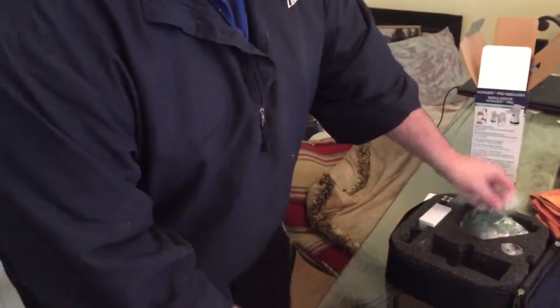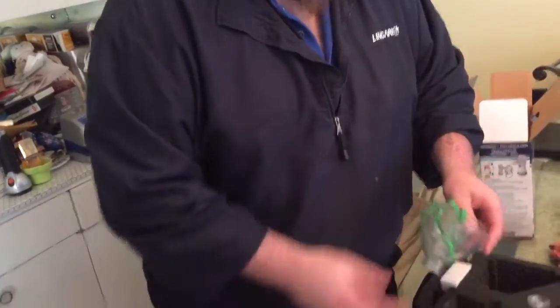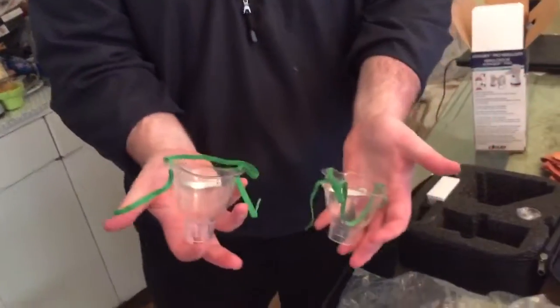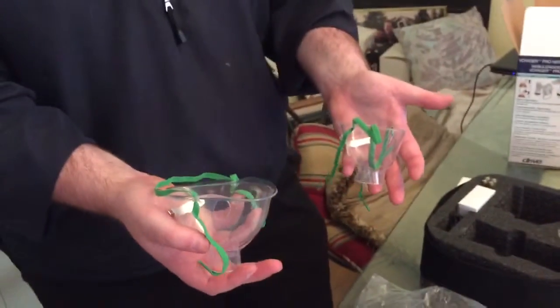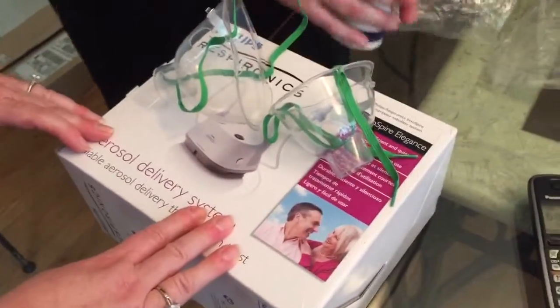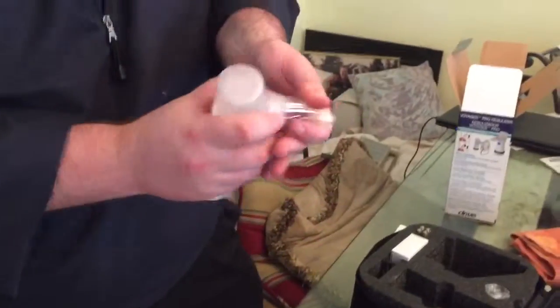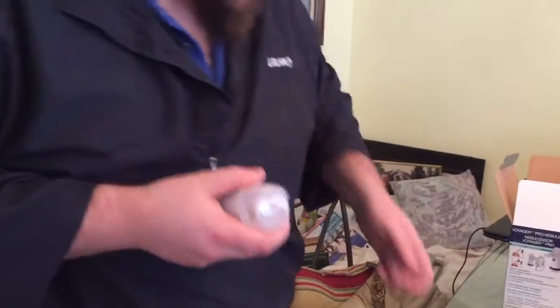I thought it was really cool that these come with masks — I say masks because it also comes with a pediatric size mask as well. To hook these up, I'm going to disconnect the mouthpiece.